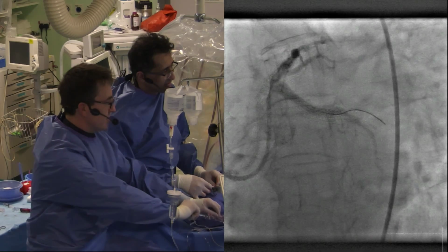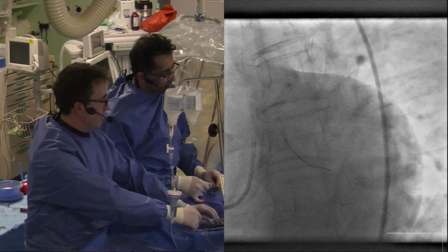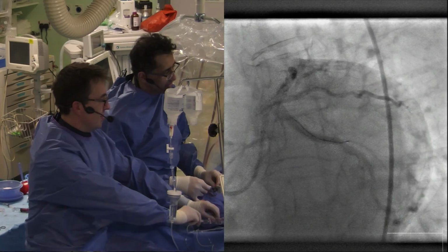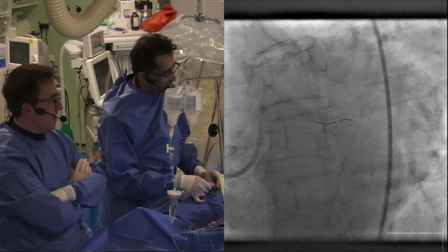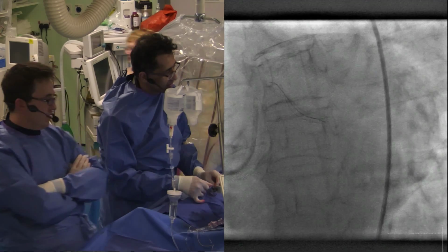So I have to say, I was wondering to myself then that if you were actually going to have to take that back and put a little bit more bend on that wire, but it seemed to go down. Little test again. I think it's trying to find that other branch. Okay, so I'll come back a little bit further. Okay. It's wanting to take that little branch, which is interesting, isn't it?